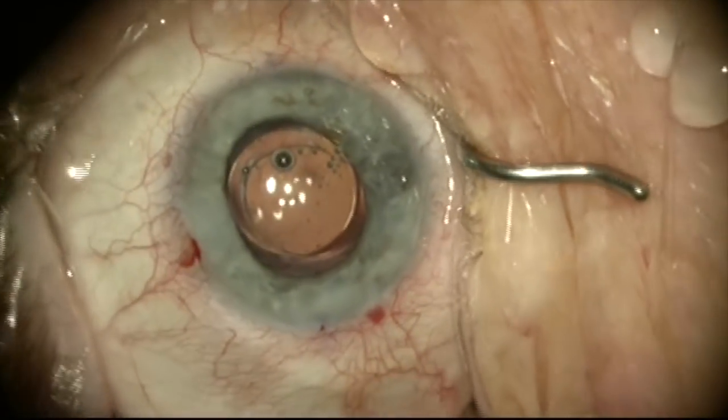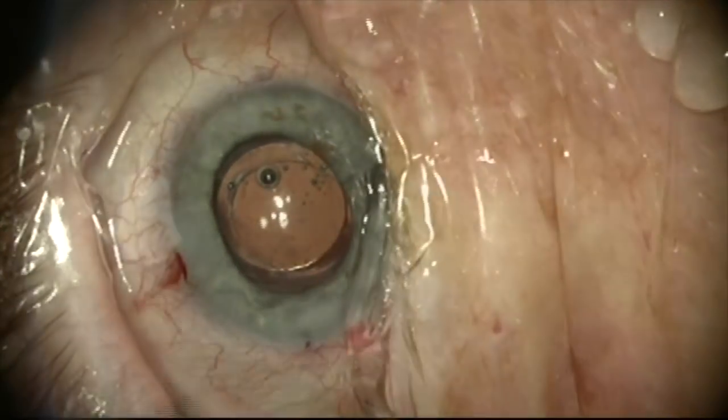This is what the patient looked like at the slit lamp one week post-op. She now has a clear lens and she's very happy with this outcome.